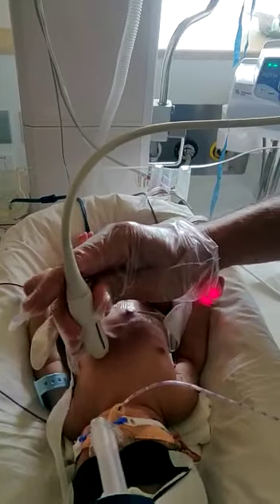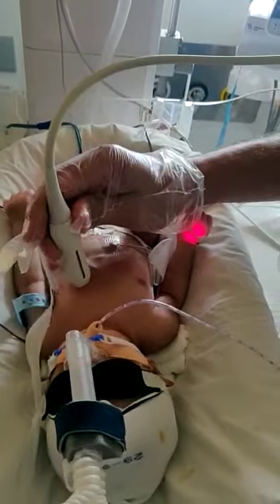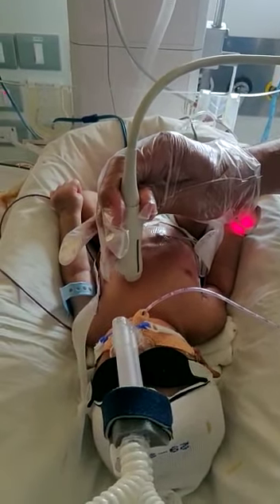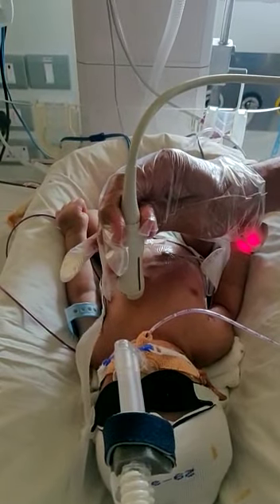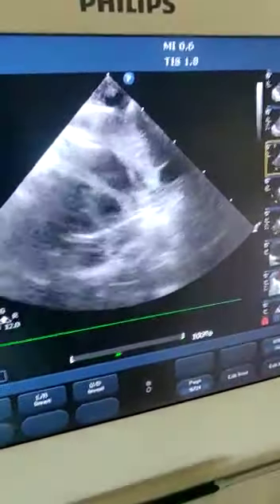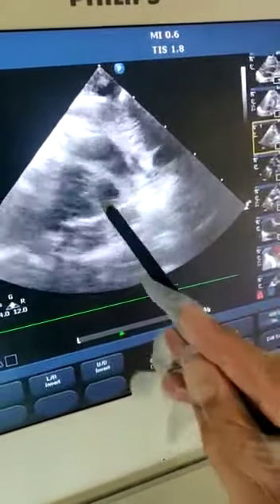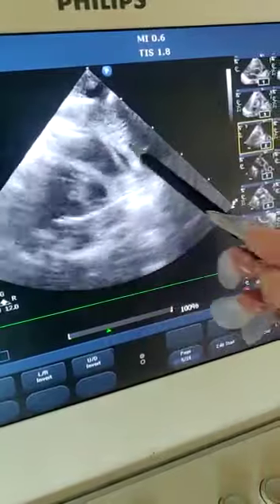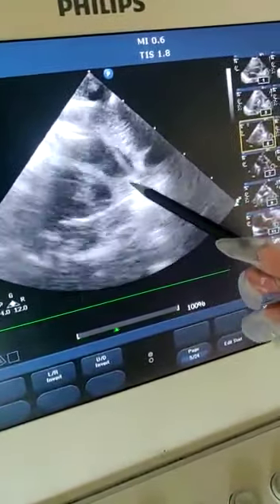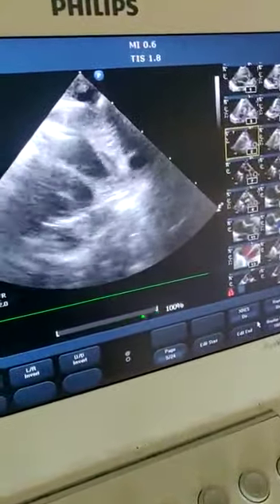Again, this is the parasternal long axis I was talking about, just a little bit modified. You can appreciate the images on the echo here. On this modified parasternal long axis view you can see the left ventricle and the right ventricle, and the right ventricle is opening into the aorta. This can also be appreciated on color Doppler.